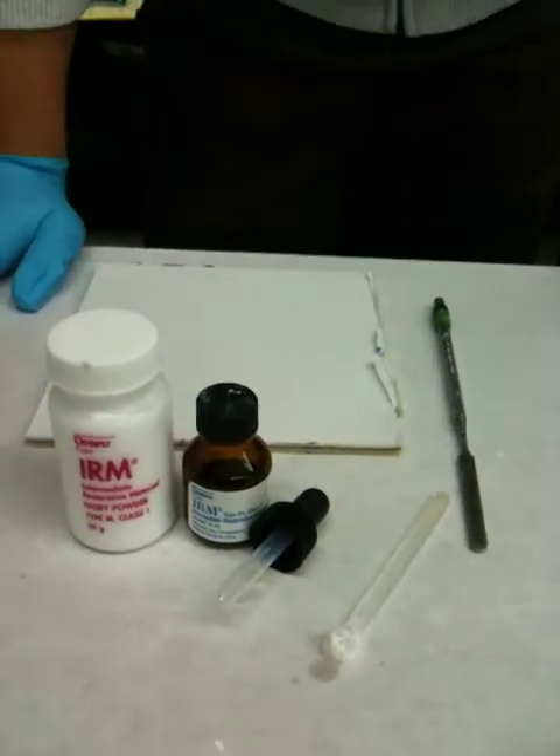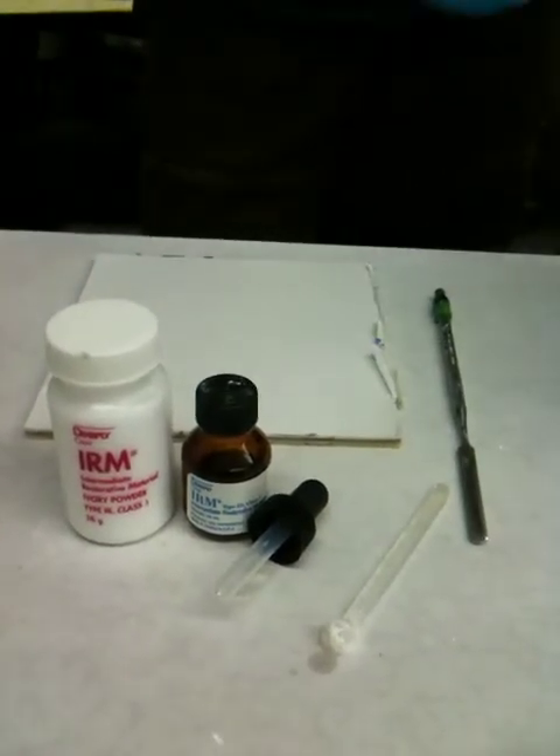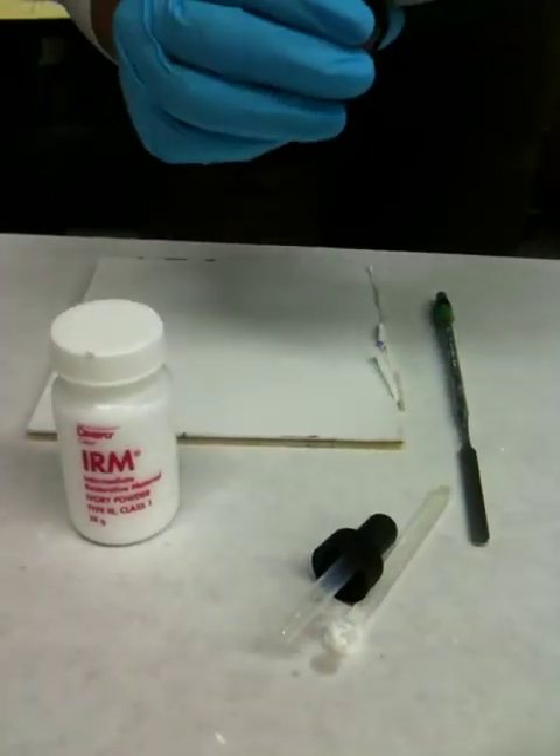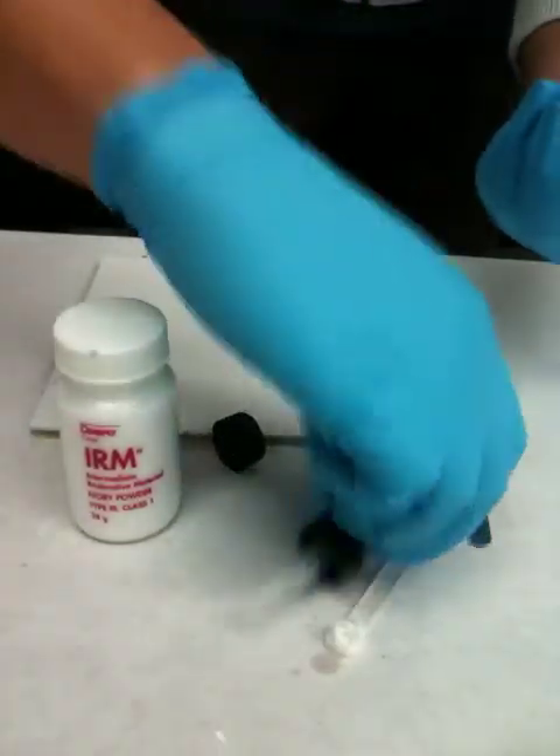All right, in mixing zinc oxide IRM as a temporary cement, you're going to dispense three to five drops of the liquid.